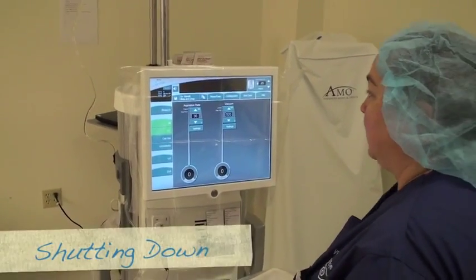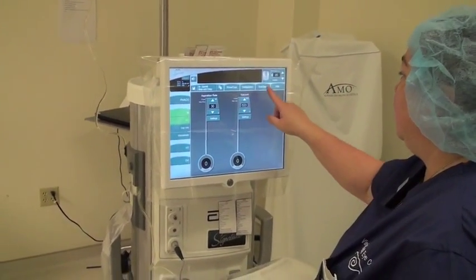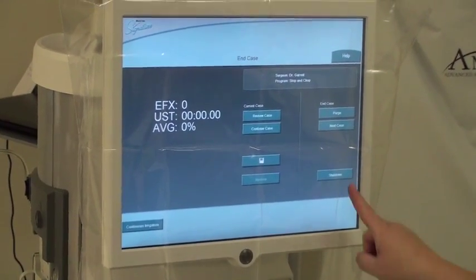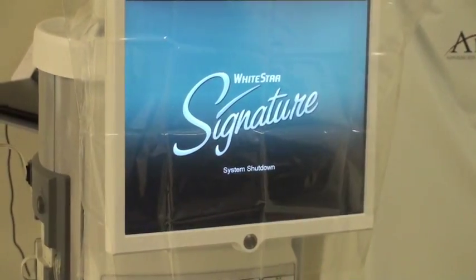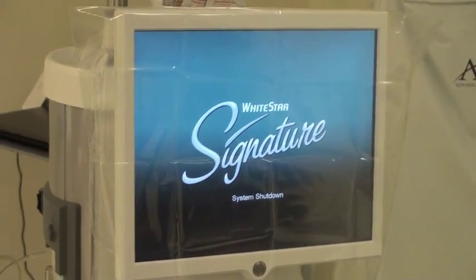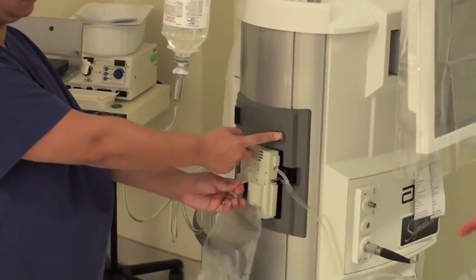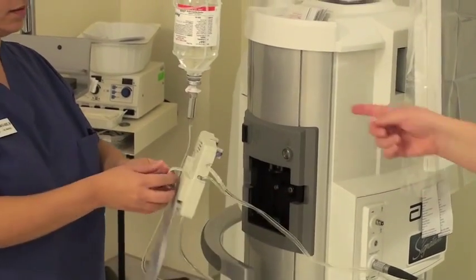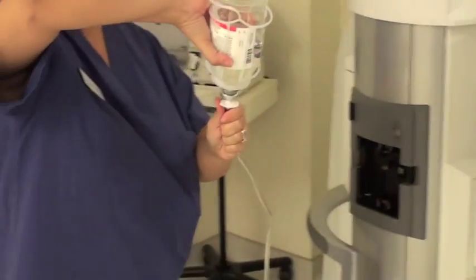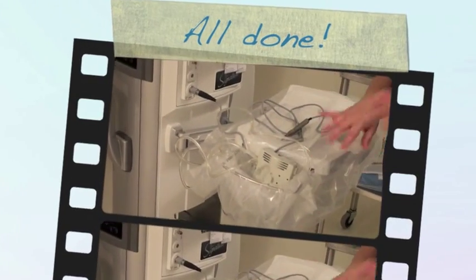Once you're all done with your case, the machine will automatically go to the end. But if not, you just hit end case. It will come up and you can shut down — continue to shut down — and then it will shut the phaco machine down. To remove the tubing, you press that silver button and it will pop the unit out, and you just pull it out and take it out of the bottle. Then we just put it in here, take this off, and throw it away.